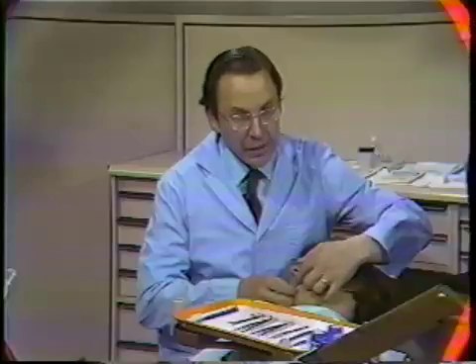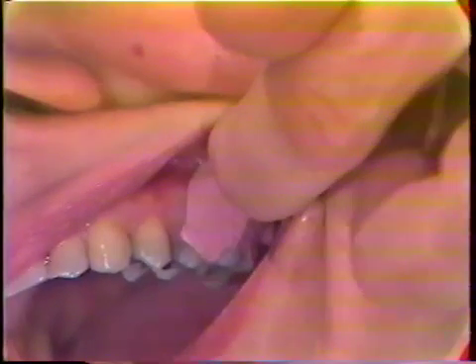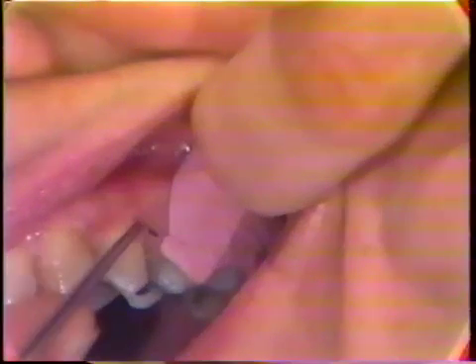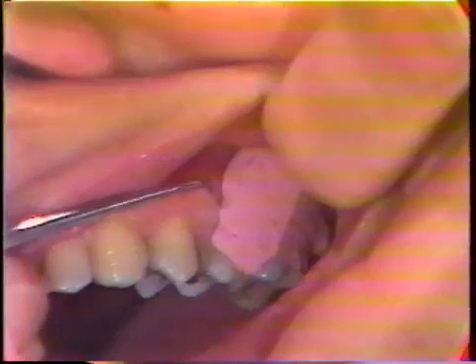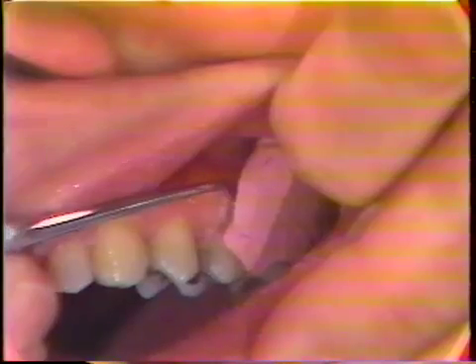We'll now proceed intraorally. The dressing on Marian's mouth is in the upper left-hand quadrant, around the back three teeth — the second bicuspid and the two molars. When removing a dressing of this type, it's important to have a rigid instrument, and that's what this Wesco scaler is. The very tip of it will be placed underneath a margin of the dressing and worked against the dressing to remove it. You can see how I'm pushing this up and it looks like this is going to come out very easily.